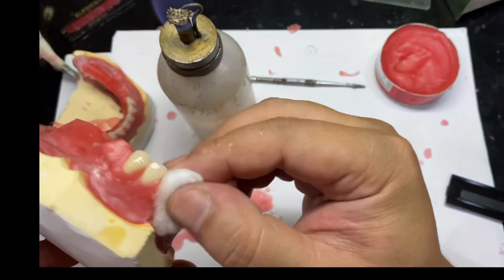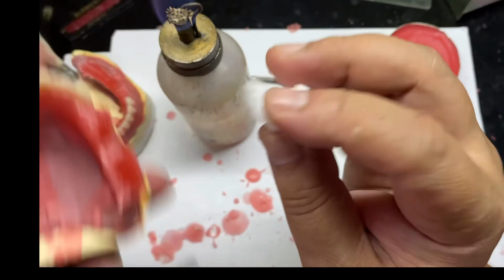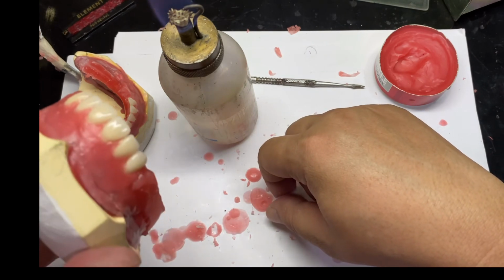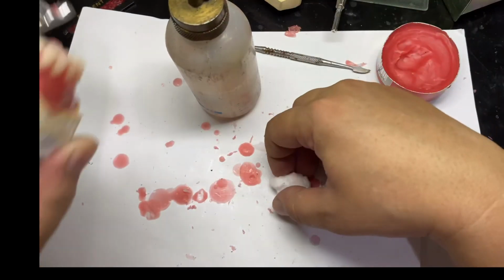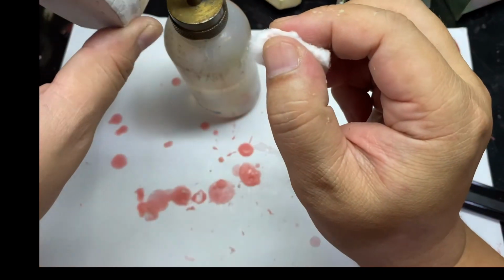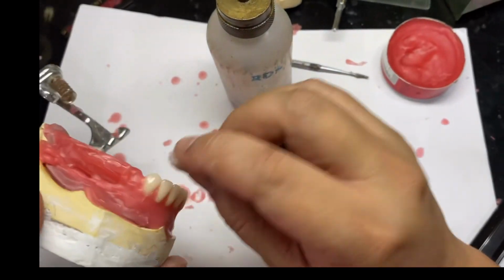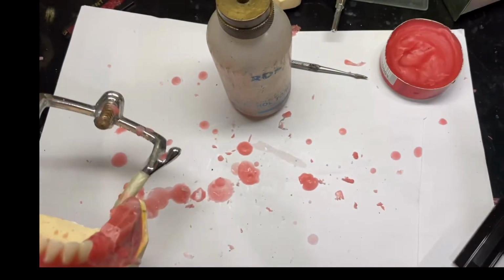It should look shiny, which means that there's no more wax residue on the surface of the teeth. Just be careful in doing this, you might alter the setting.